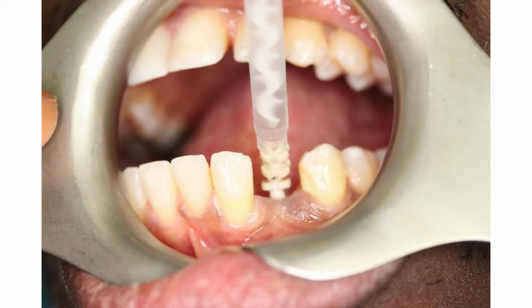And for this you need an impression material that actually sets very accurately and also very, very hard, because if you have a soft impression material that sets in a soft set, then it won't be sufficiently rigid enough to pull the transfer, or the quick transfer, off of your implant. Position the nozzle of the gun on top of the quick transfer, because you're going to be injecting impression material down through the top of the quick transfer.